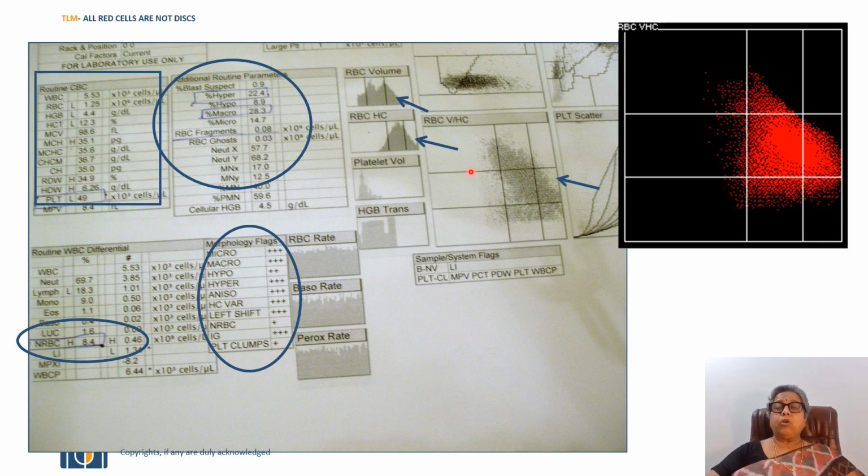So all these features are already present, and I'm able to see it from the histogram and from the scatter plot. There's a lot of shift to the right, a little bit to the bottom and a little bit to the top. So you have a wide array of cells with anisocytosis and poikilocytosis. So this will be anisopoikilocytosis, probably 2 plus or 3 plus depending upon the smear. The NRBCs are also present. They will be seen on the WBC scatter. Now, the flags: microcytes, macrocytes, hypochromic, hyperchromic, anisocytosis, hemoglobin variation, left shift, NRBC, IG, platelet clumps. The whole garden is there.